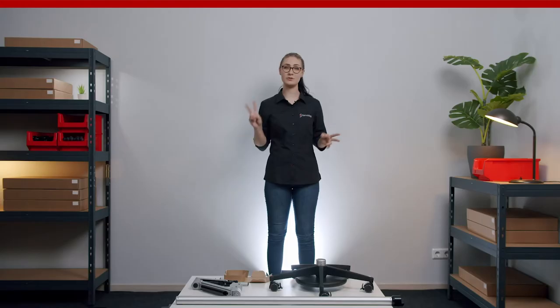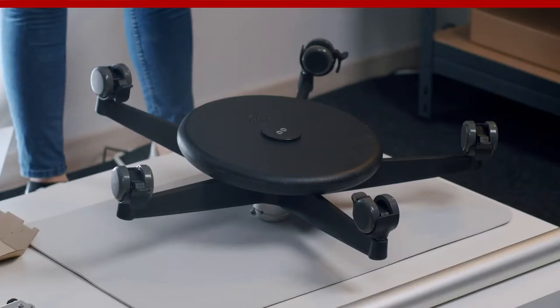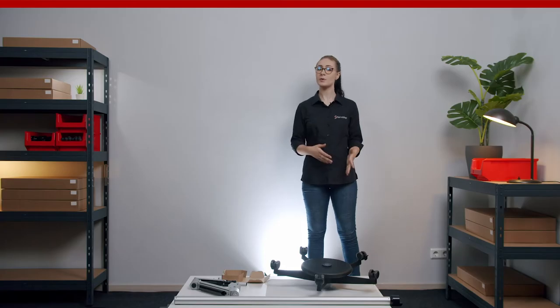So let's get started. The floor stand is typically shipped in two packages, which we've already unpacked. Here are all the parts and tools included. Take the chassis, turn it upside down and place it on a soft surface like a carpet or a floor mat.